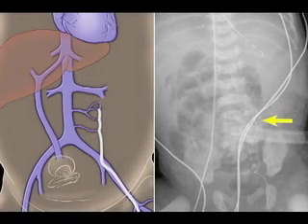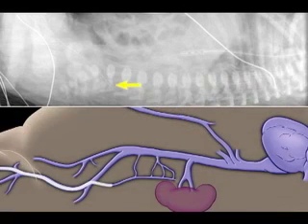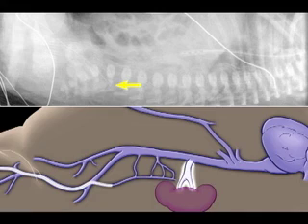When the catheter tip lies within the area of the inferior vena cava but does not advance to the region of T8 to T10, or when the catheter takes an unexpected course, or bends, kinks, or curls in the area of L2 to S1, it may be malpositioned. Consider obtaining a cross-table lateral film to ensure that the catheter has not entered lumbar or renal venous circulation. The catheter can erroneously divert into the ascending lumbar veins before reaching the inferior vena cava. The ascending lumbar veins arise from the iliac veins at the level of L5 to S1. Renal veins exit at the level of L2.